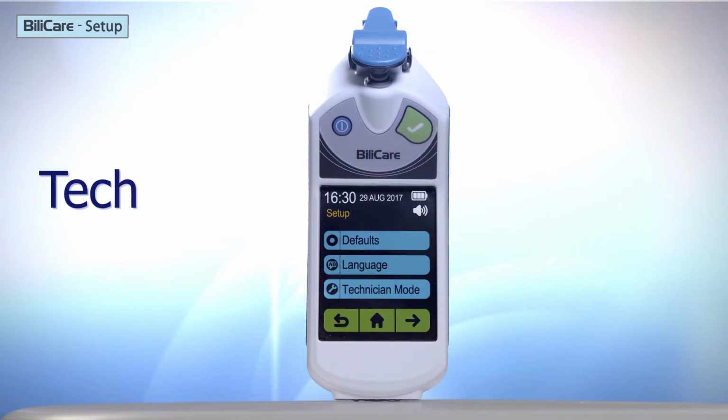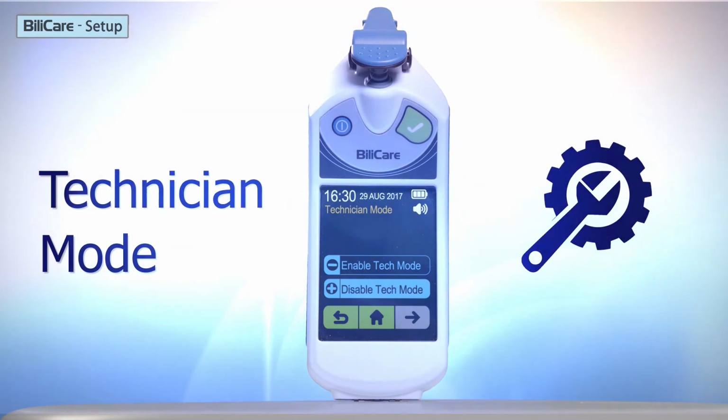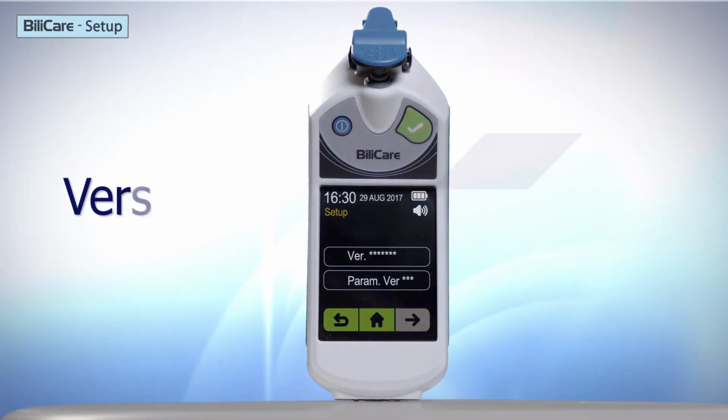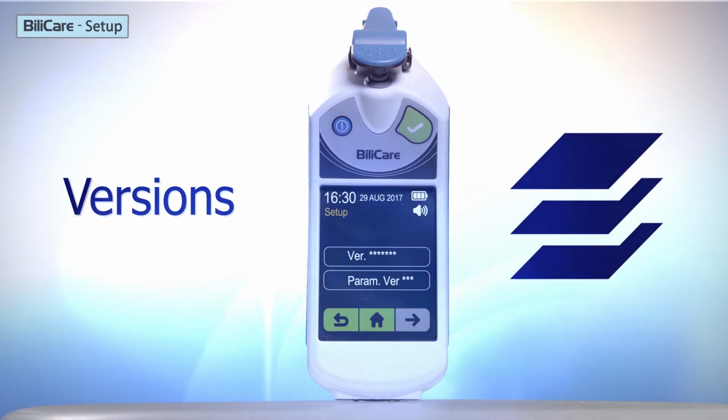The Technician Mode menu is for use of authorized technicians only. Normal operation must be in Disabled Technician Mode. Version screen. The last setup screen displays the versions of the installed files on your BiliCare.